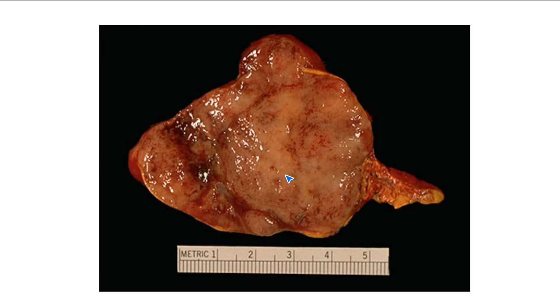How is the chromatin arranged? What kind of pattern do we talk about? So no one remembers the term stippled chromatin? So we have these little bits of chromatin together with areas with none, and so we call it a salt and pepper arrangement.